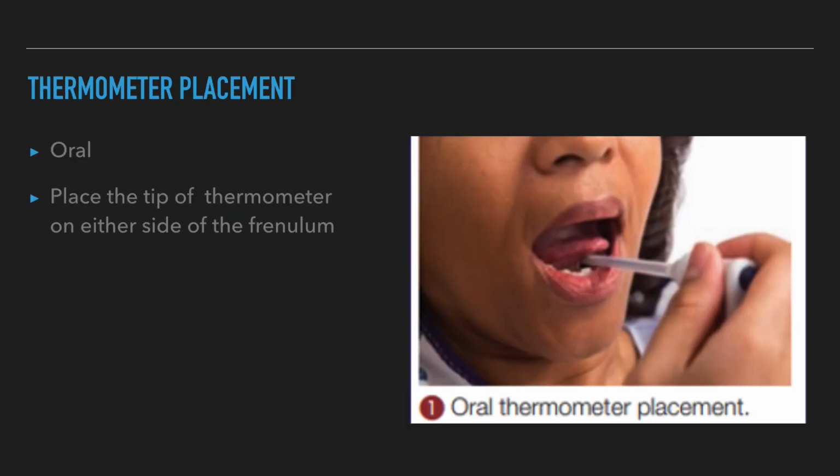Insert the probe below the client's tongue and into the sublingual pocket of the mouth. Ask the client to close his or her lips around the probe. Hold the probe, supporting it in place. Rationale: inserting the probe into the sublingual pocket obtains the most accurate temperature. The weight of the probe will displace it from the sublingual pocket if left unsupported.